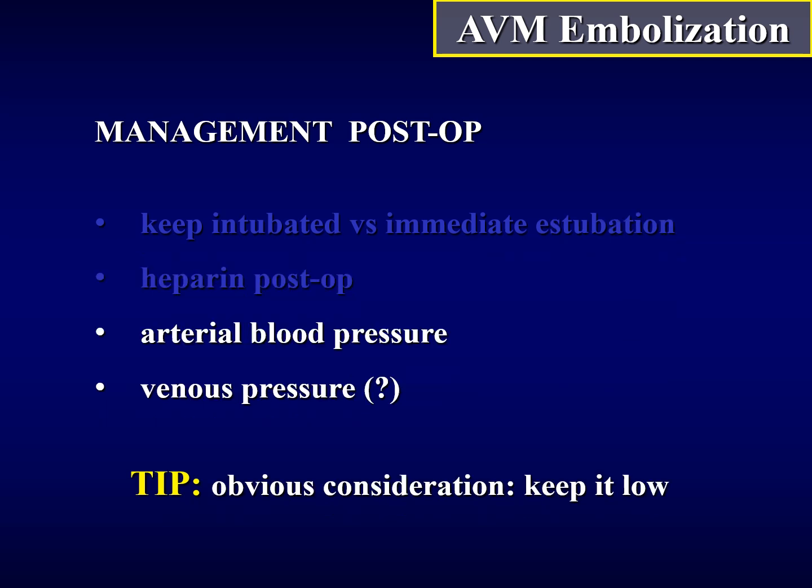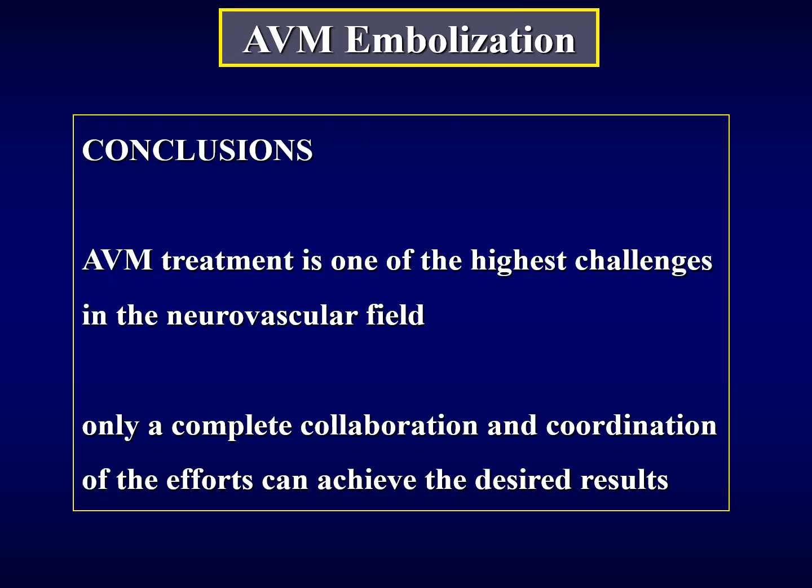Should we keep arterial blood pressure low and venous pressure low? Yes, this is pretty obvious. We should not have a rise in blood pressure immediately after an AVM embolization.